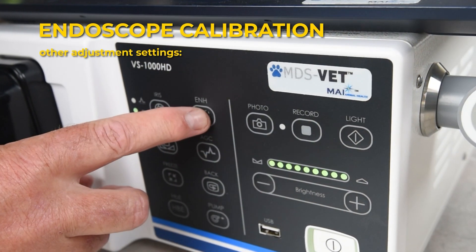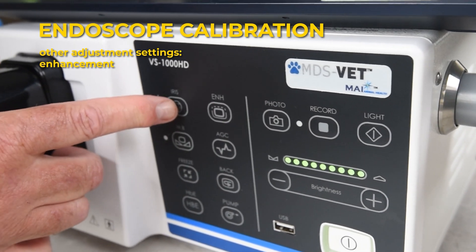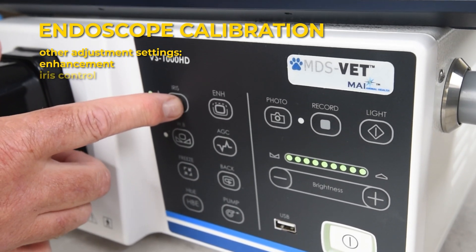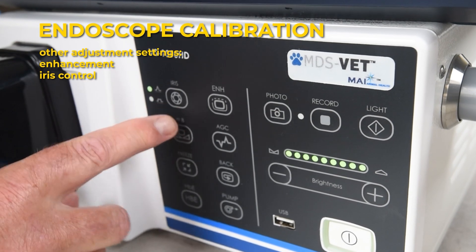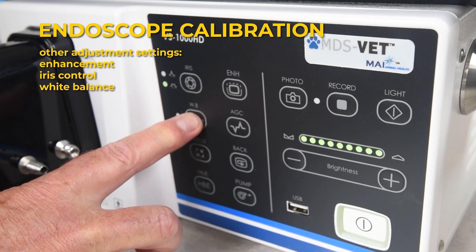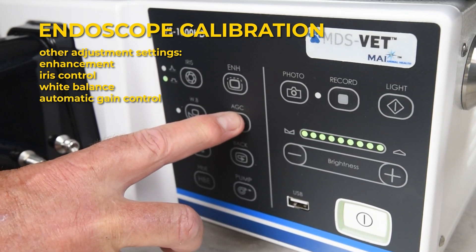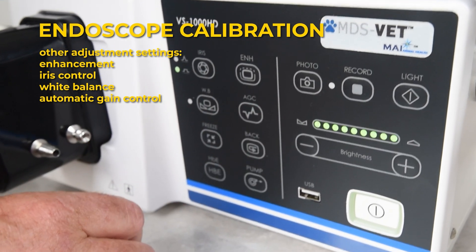Other adjustment settings include: Enhancement, which controls the sharpness of your picture; Iris control, which allows adjustment of the amount of light coming into your camera; White balance, which adjusts the base white color that the camera uses for all other colors; and Automatic Gain Control, which controls how strong the display is.